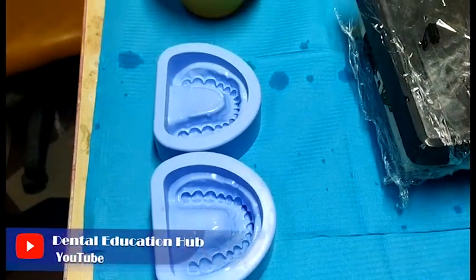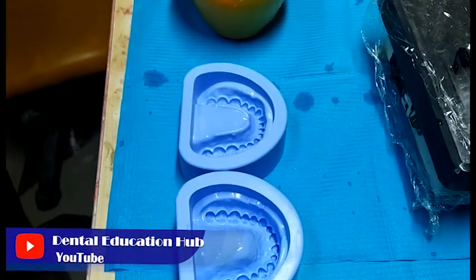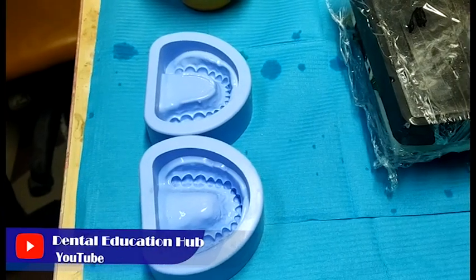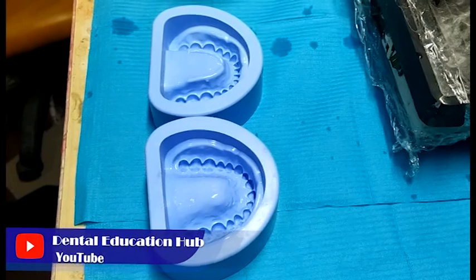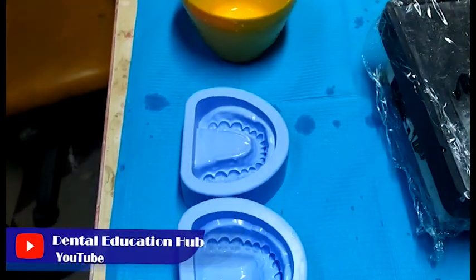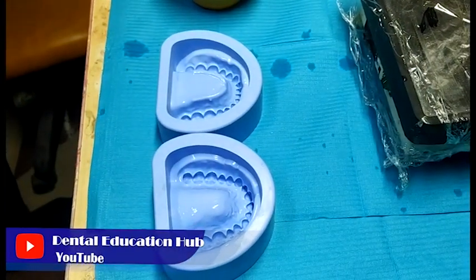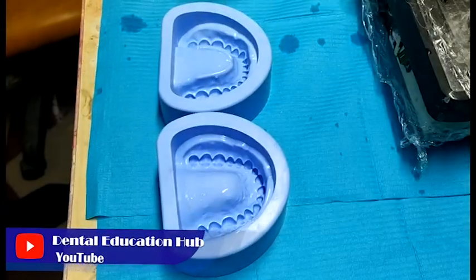Welcome to Dental Education Hub YouTube channel. In this video, I'll show you how to pour dental stone into dental molds and prepare ideal dental models. In the blue color, these are the upper and the lower jaw rubber molds. In the yellow color, this is a rubber bowl that will be used for the mixing of the dental plaster for a good quality mix and the production of ideal dental models.